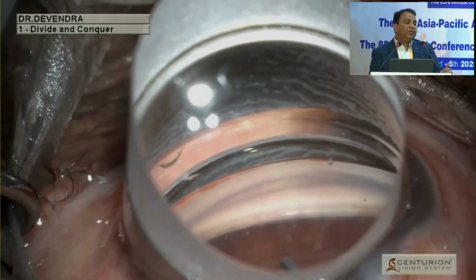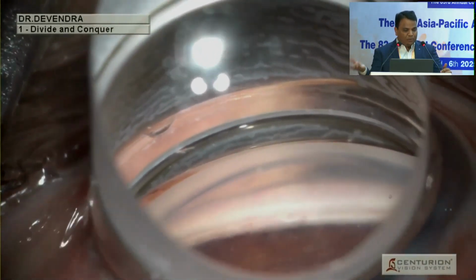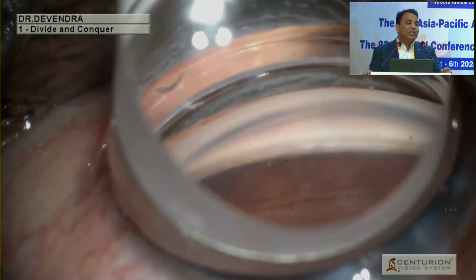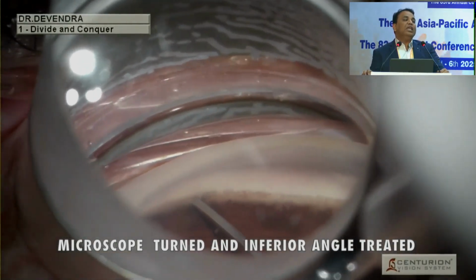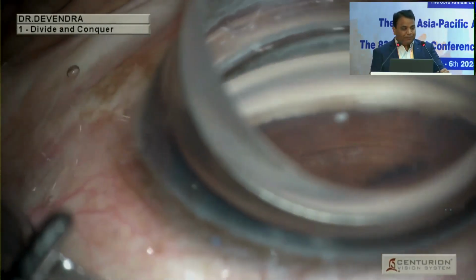Once we complete the nasal angle, you turn your microscope, shift to the opposite side, and treat the temporal angle also. This is the nasal angle in high magnification, and again here I am treating the temporal and inferior angle. Only thing, you need one extra side port when you're treating the temporal angle.